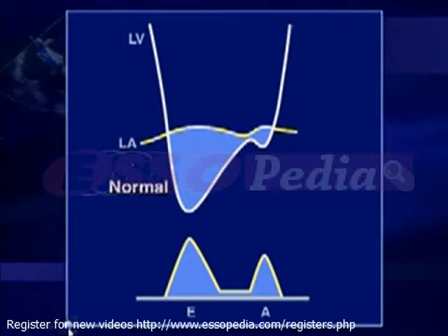Now there are a number of factors which affect LV diastolic properties and filling of the left ventricle. And it is really the interaction of all of these which reflect the diastolic transmitral pressure gradient, that which ultimately determines mitral inflow and the mitral inflow velocity pattern. Two important factors are left atrial pressure and the rate of relaxation of the left ventricle.